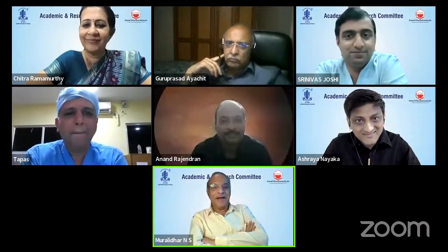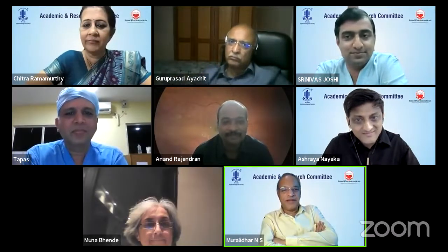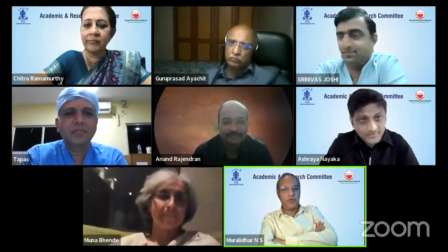I'm quite happy to see that some of the things which used to exist before are being rediscovered now, and more and more uses are being found. I remember when we had the direct ophthalmoscope. We still have them, but I don't use them anymore. It had a green filter, and we used to use that quite often earlier also.